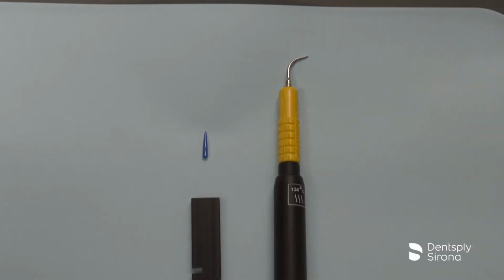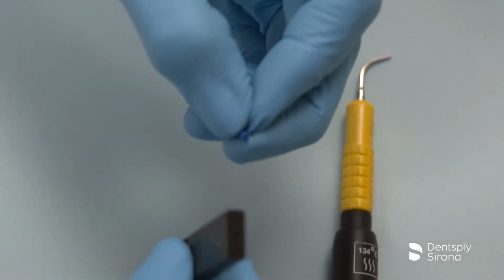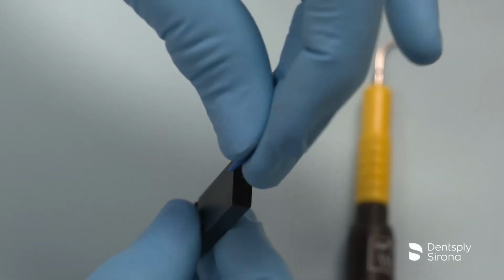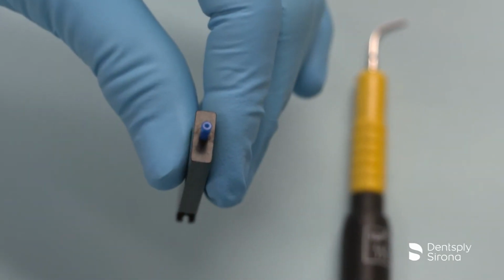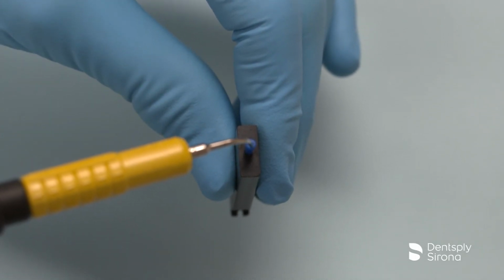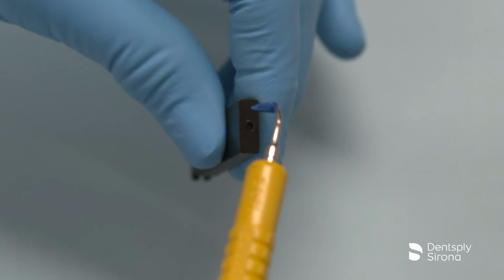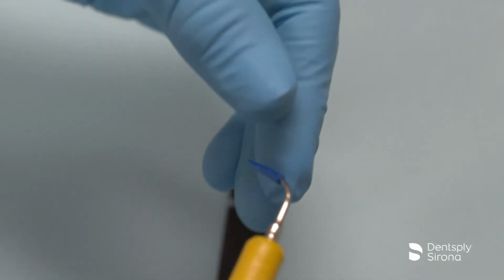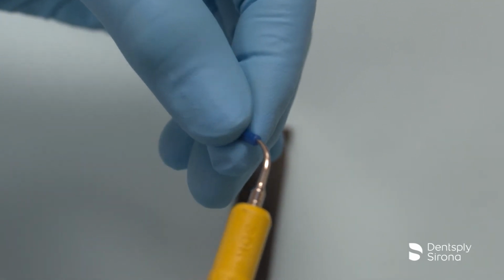To prepare the Cavitron Ultrasonic Implant Insert for use, take a new plastic soft tip disposable prophy tip and place it point first into the hole in the end of the wrench. Insert the metal tip of the insert into the opening of the prophy tip and twist 1/4 turn while applying firm pressure to securely seat the disposable prophy tip on the metal insert tip. Disengage the prophy tip from the wrench and gently pull on the prophy tip to verify that it is securely in place.